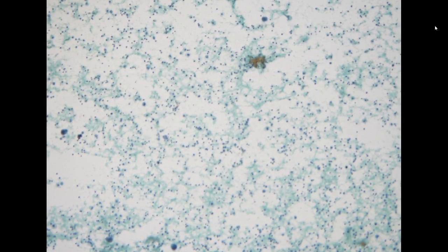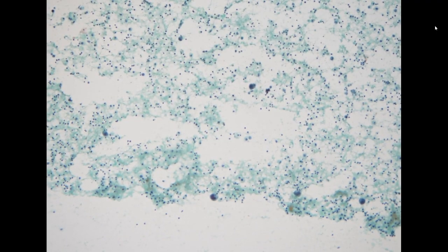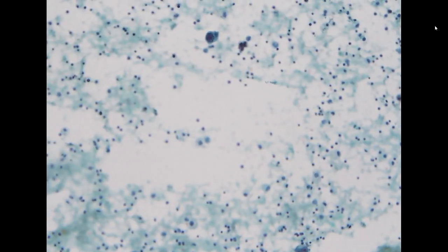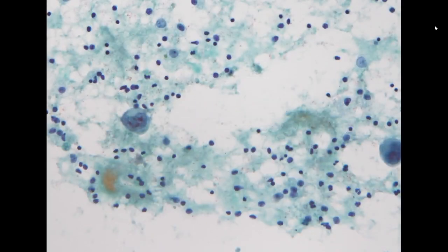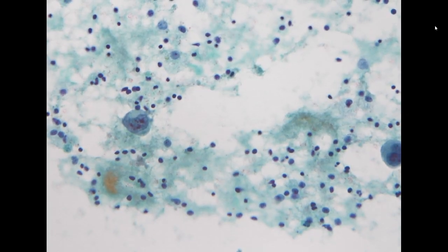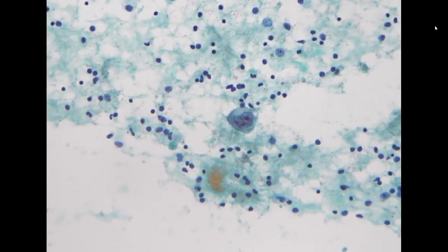Next specimen is also a pleural effusion. I think it's also lung cancer. So she has been confirmed with lung adenocarcinoma by pleural effusion cytology and cell block last week. So we do a TTF1 on another specimen from this patient, and this is positive for TTF1.